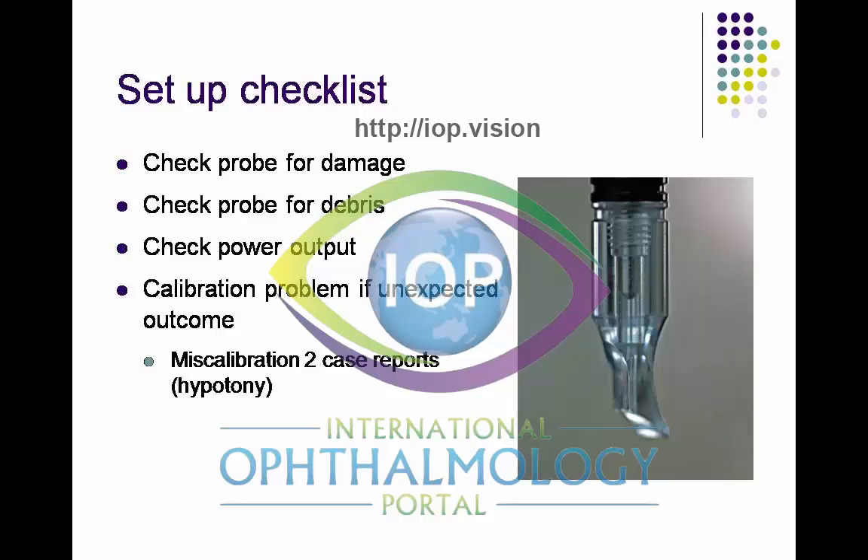As part of the checklist, examining the probe is key. Check the probe for damage. As you can see, the fiber optic cable runs down the center of the image on the right-hand side. The most important thing is that at the tip, it should be a smoothly rounded tip — not sharp or fractured.